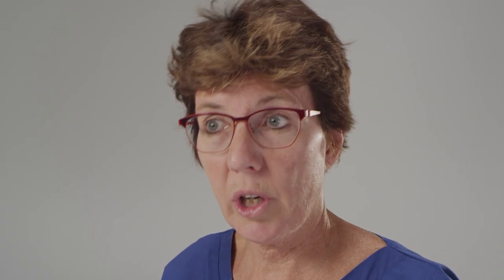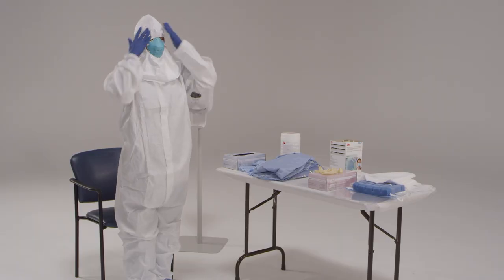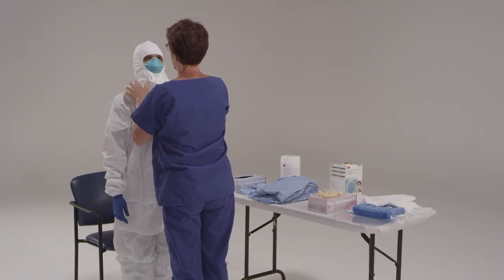Now we're going to inspect the hood before we put it on. Be certain the hood completely covers the ears and neck. The trained observer should check to ensure the hood is in place and that all parts of the skin are covered, no hair is hanging down, and the hood extends to the shoulders.